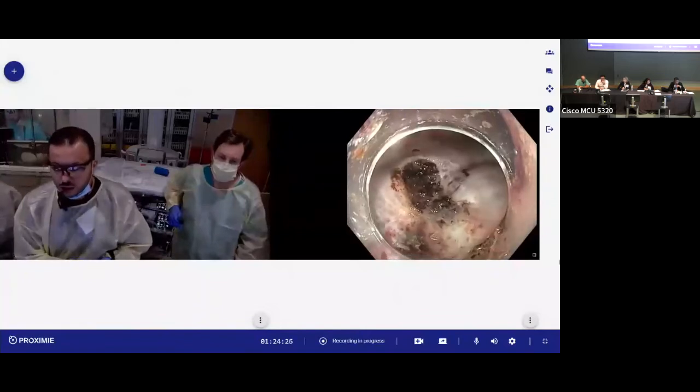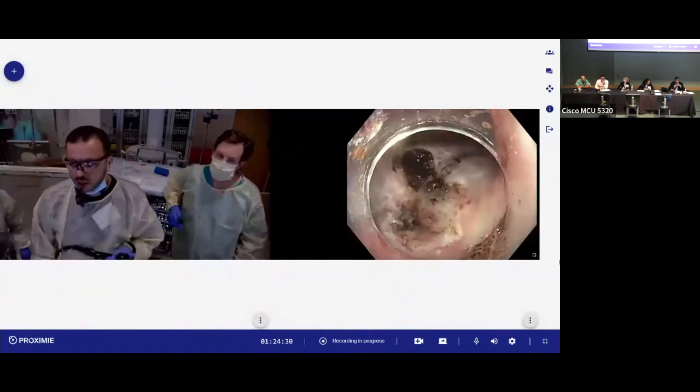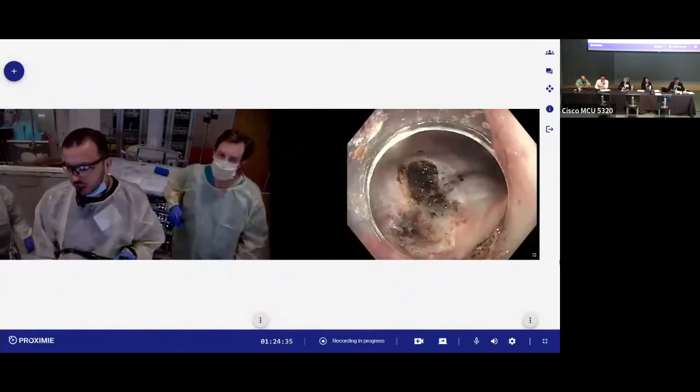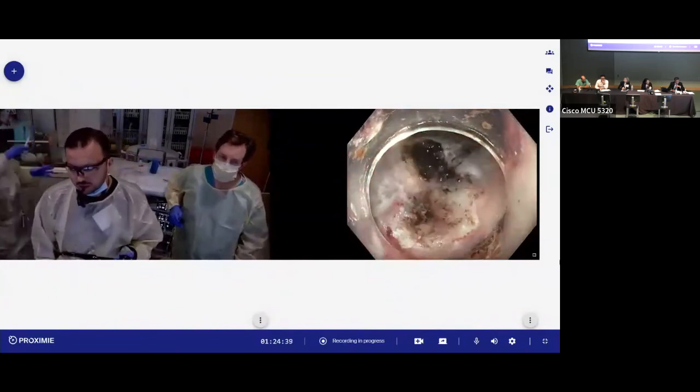Yeah, agreed. You could argue that colitis is a special kind of consideration for the risk of bleeding, but certainly I agree with that. It's probably going to cause more harm than benefit here.